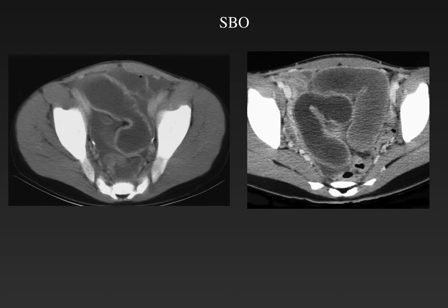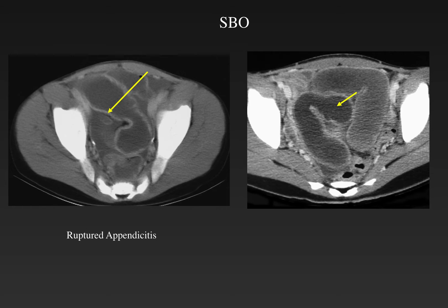Here are two other patients with dilated fluid-filled obstructed bowel. The patient on the left has a fluid-filled appendix, and the small bowel obstruction was caused by a ruptured appendix and secondary inflammatory changes, a common cause of small bowel obstruction in children. The child on the right shows a dilated tubular structure on both sides of the pelvis of different densities. The small bowel obstruction was caused by inflammation due to a tubo-ovarian abscess.